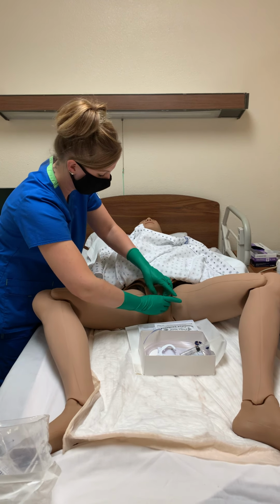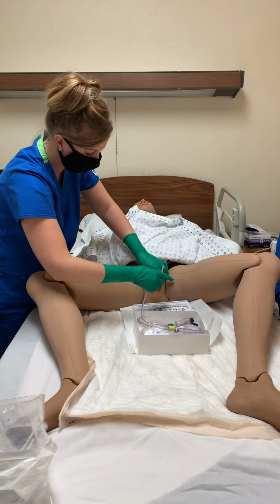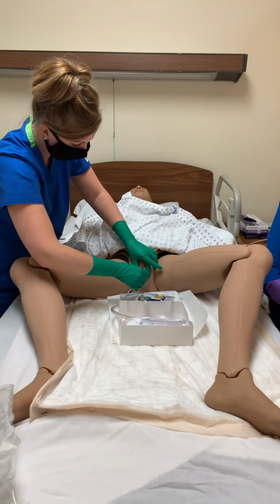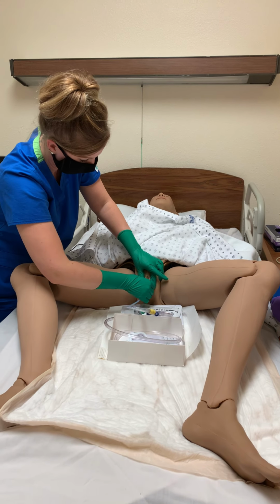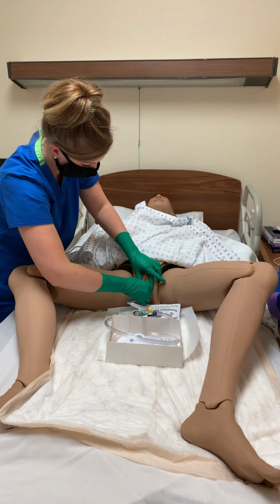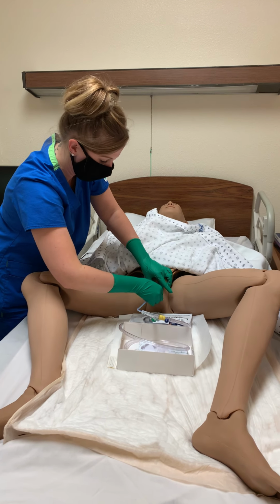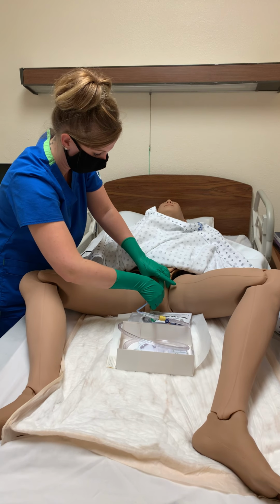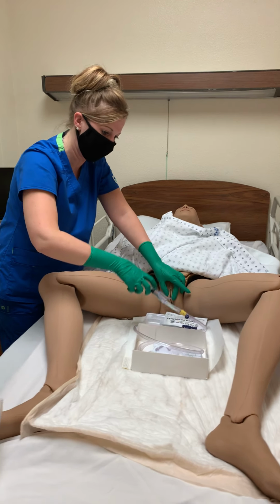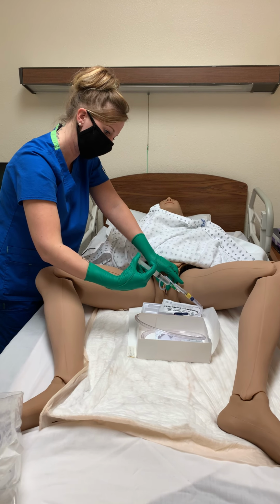Okay, Joanne, when we start this, I'm going to need you to bear down, take a deep breath, so we can get this inserted properly. Are you ready? Yes, ma'am. Okay, 1, 2, 3. I would go in until I feel a little bit of resistance, and then once I see urine coming back through is when I would push it in another inch or 2. So we've gone in. I would take and add my 5 milliliters of water. Perfect.